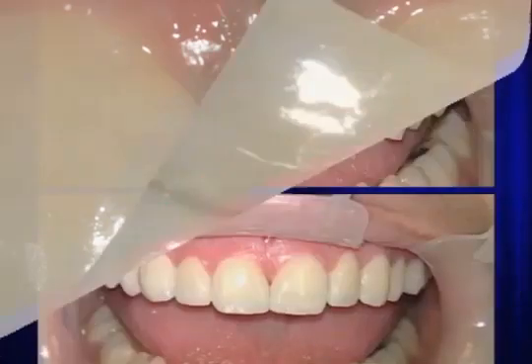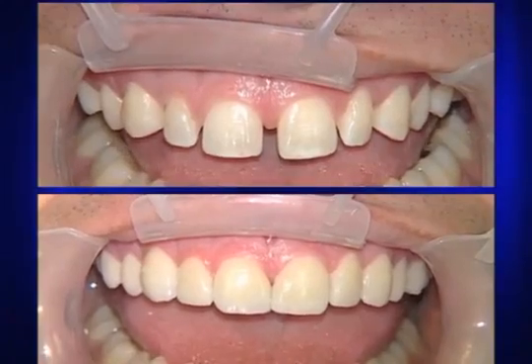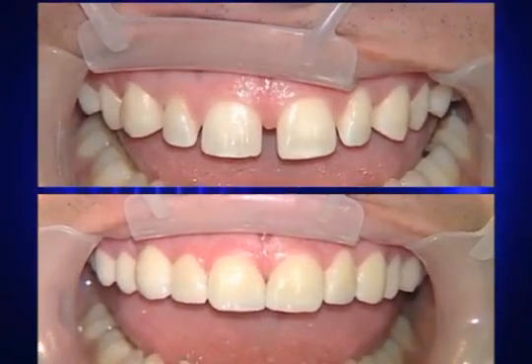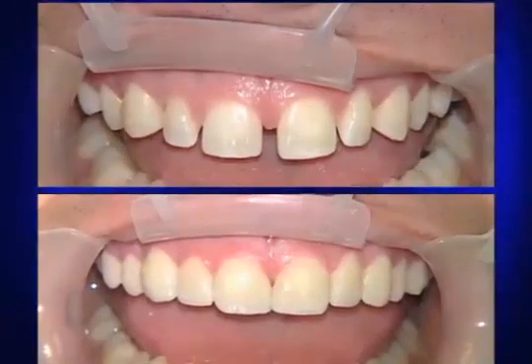If you do want to close that completely, or if that's one of the patient's requirements, I would suggest that you prep the veneers, you prep 8 and 9 and drop the margin slightly subgingival, use a soft tissue model, and your technician should be able to close it completely.